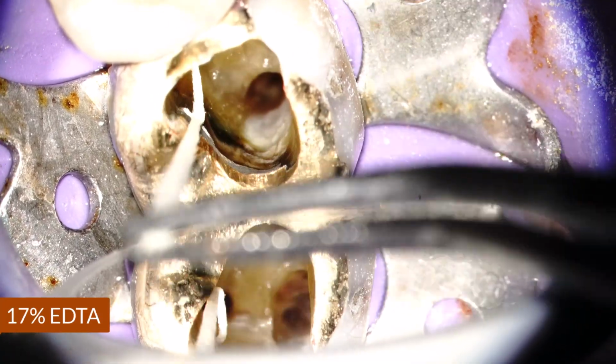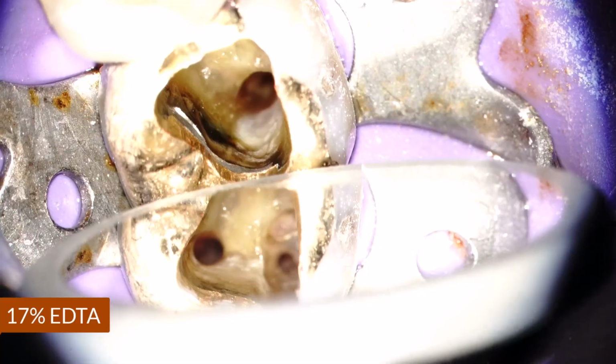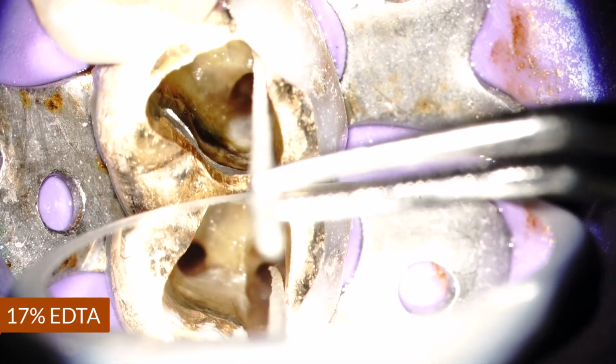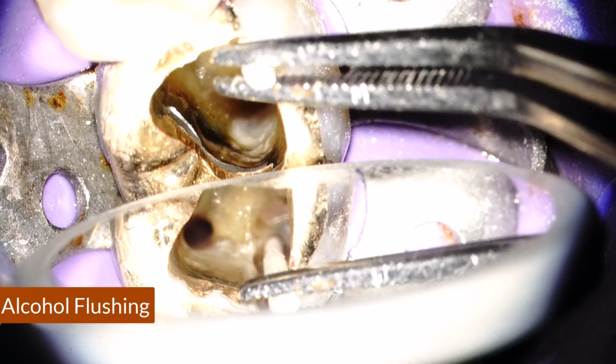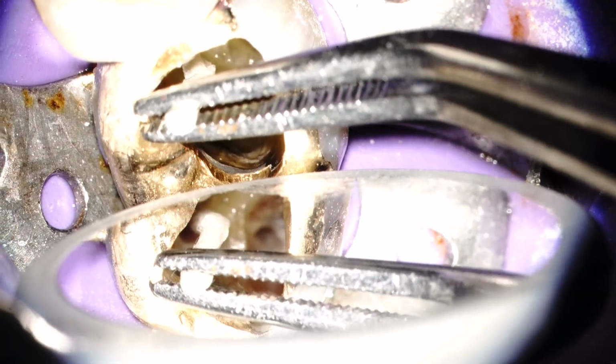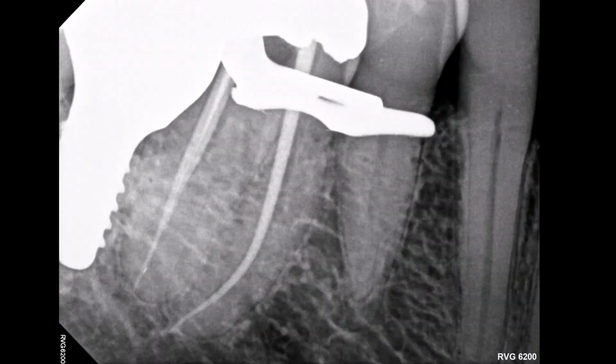Then I place 17% EDTA and I agitate with the EndoActivator in each canal for 30 seconds. Then finally I evacuate with the microsuction and flush with alcohol, then dry with paper points, and the canals are ideally cleared and dry and ready to be filled. This is the cone fitting check film showing the cone fit in the mesiolingual canal and the distal canals.